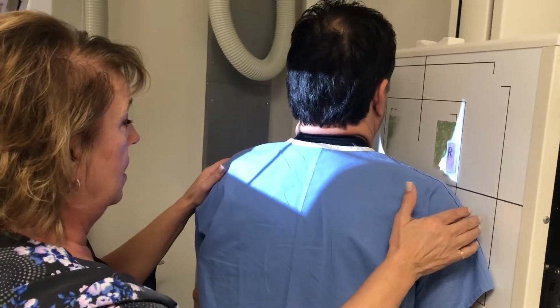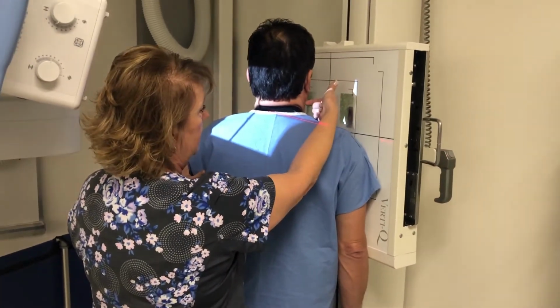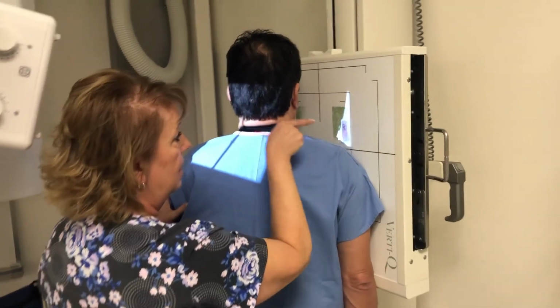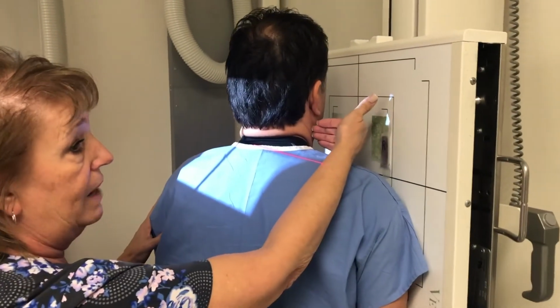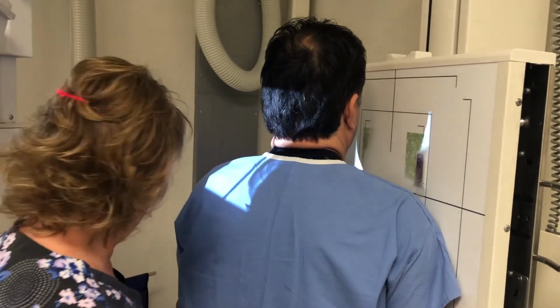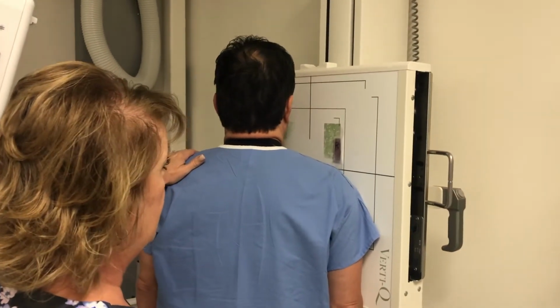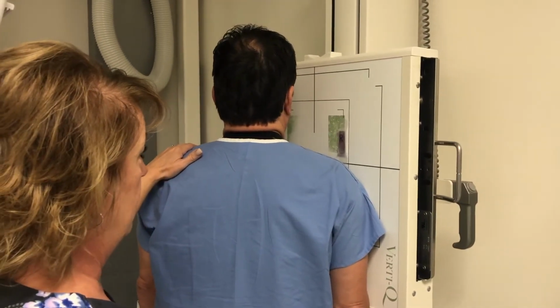So he is in an RAO position. I'm going to see the foramina closest to the IR, so I'll be viewing the right foramina on this one. So that is our RAO. I would shield, I would have him suspend breathing and take the exposure.